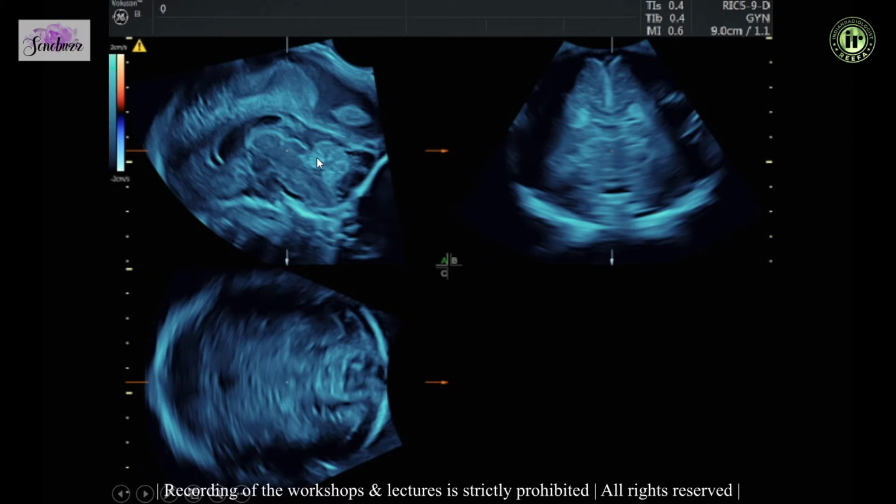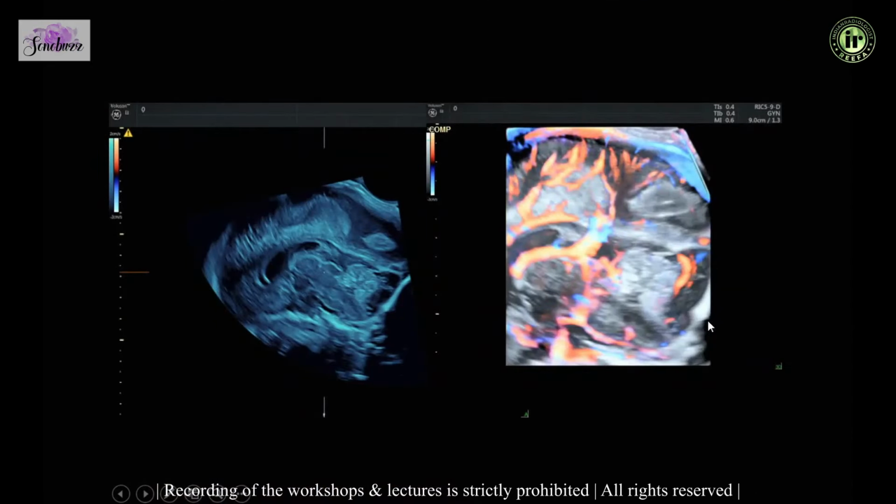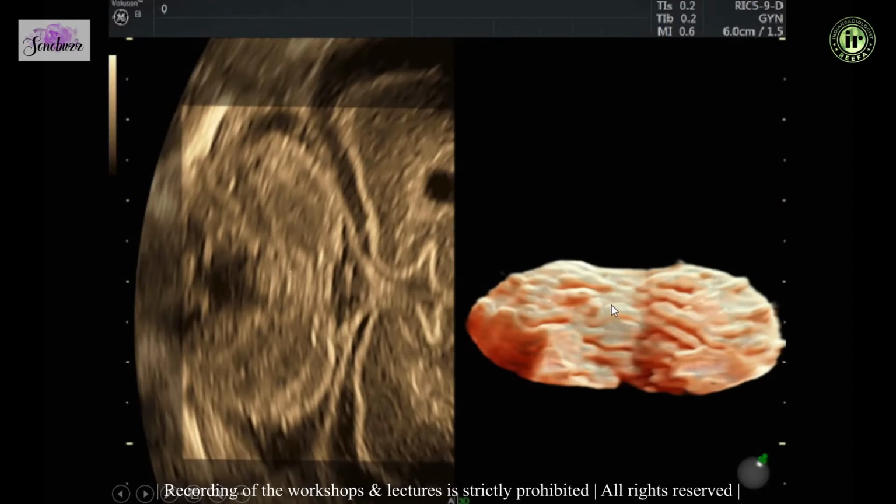You know that when there are genetic disorders, there can be pontocerebellar hypoplasia, because many genetic conditions can involve both these structures. So we need to measure all the diameters. You can also do surface rendered imaging of the cerebellar folia, especially useful for conditions like rhombencephalosynapsis, where we don't see a vermis and the folia continue through and through.